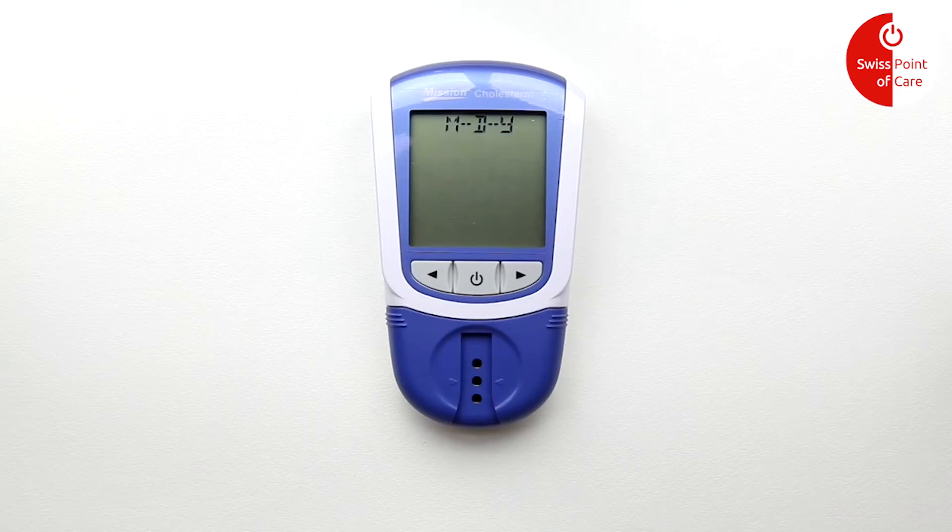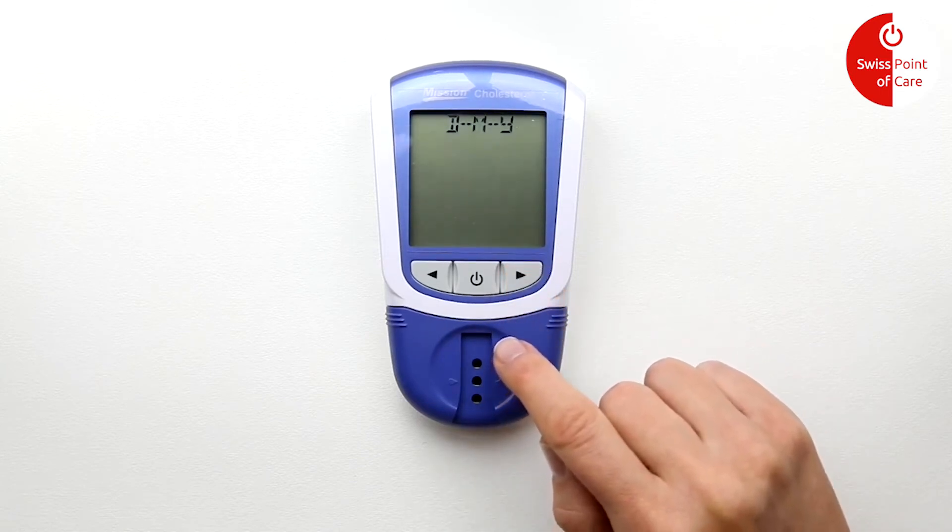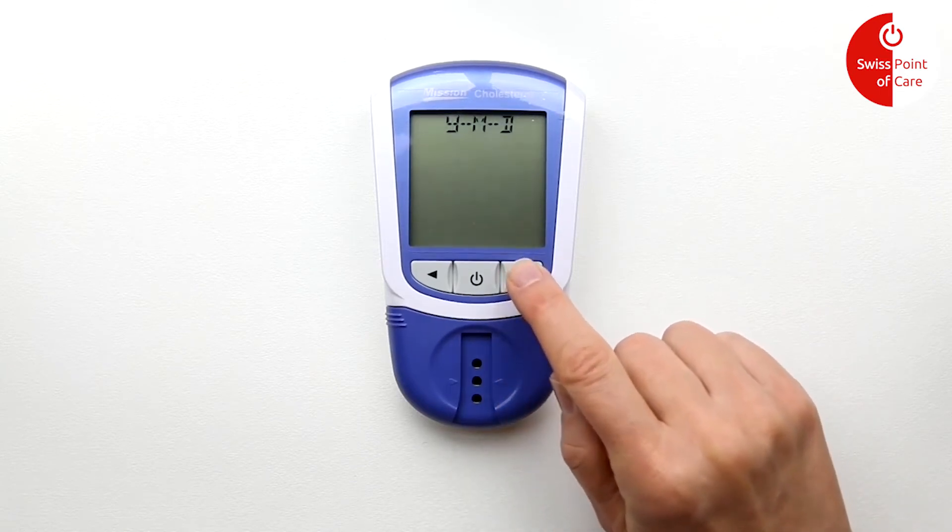Now use the arrows to choose the date format. Choose between month/day/year, day/month/year, or year/month/day. Press the power button again to save and continue.